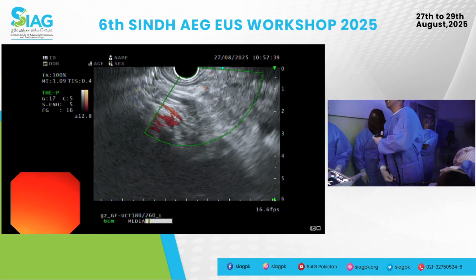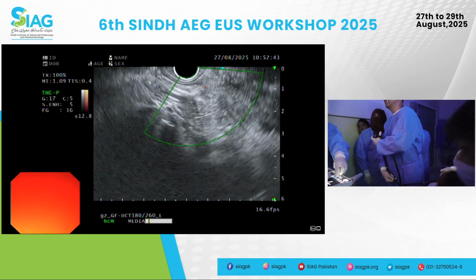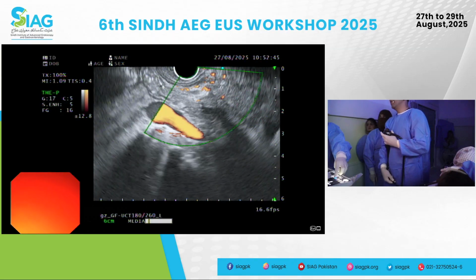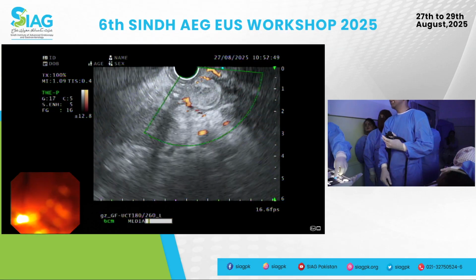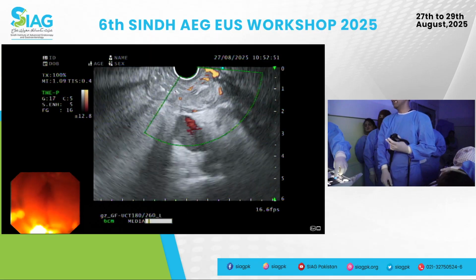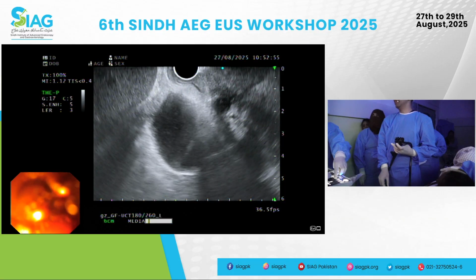So you start seeing the stent there. Okay, so it's the distal end of the CBD. So I know I'm in the right ballpark. I know this is IVC, good. And the aorta seems compressed. This is the right kidney there. That's it. Get rid of it.